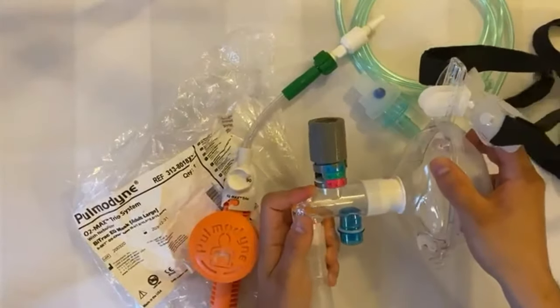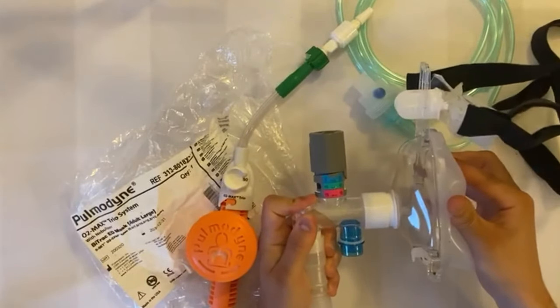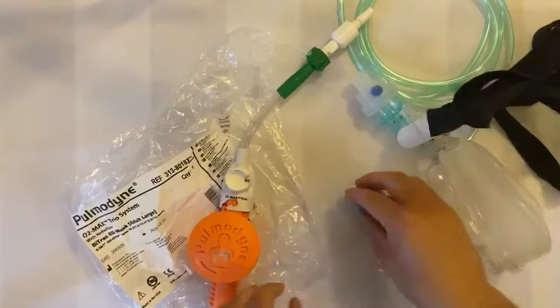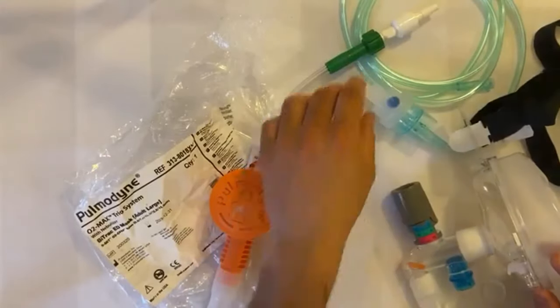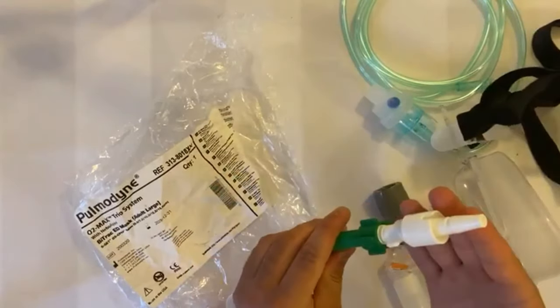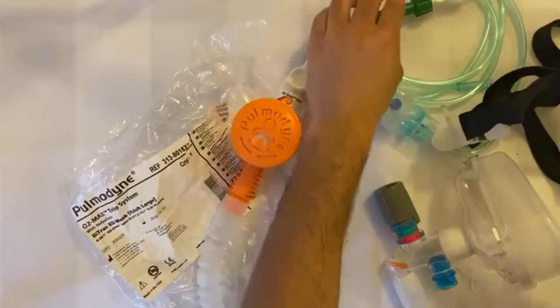Then attach the oronasal mask to the T-valve containing the PEEP dial. Use this to set your desired PEEP for therapy before making any required FiO2 adjustments. Then plug the kit into your oxygen source using the Schrader connector and turn on to begin CPAP therapy.